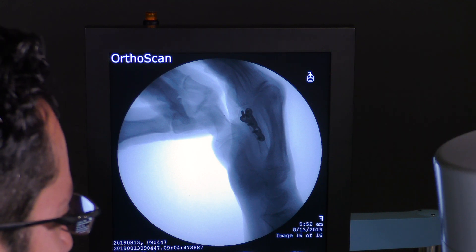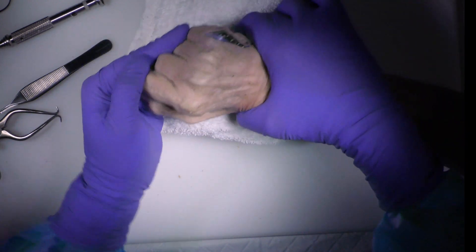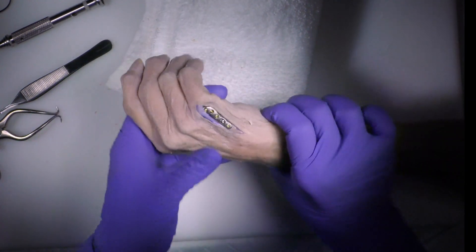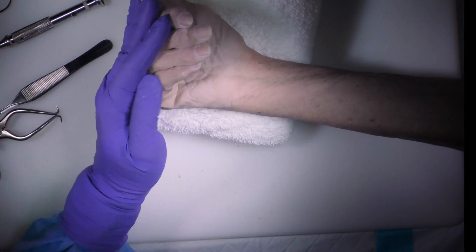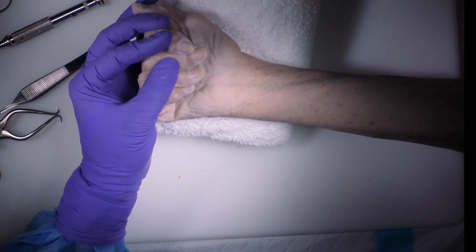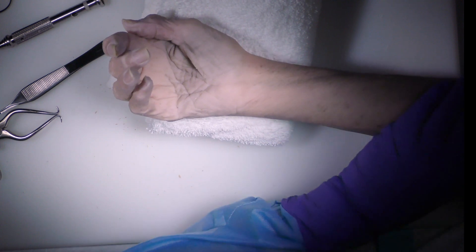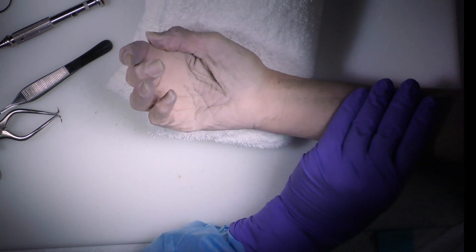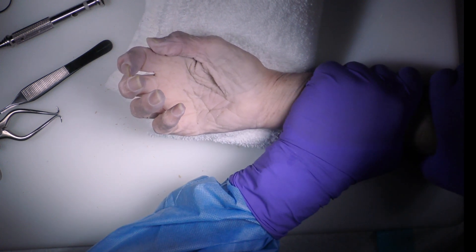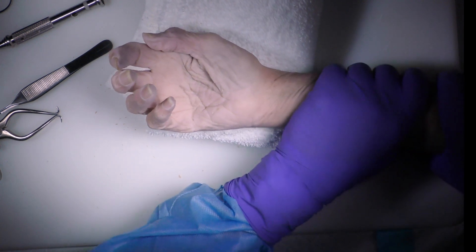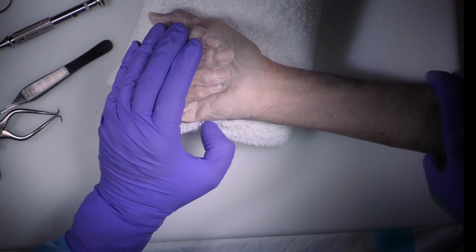They're going in different directions. When you are, whenever you're doing any kind of finger fracture surgery, you want to make sure that your cascade has been restored to your hand. It's always trickier when the patient's asleep to know for certain, but you can kind of just passively manipulate and see where it wants to go. You can tension the forearm by squeezing the forearm muscles here. Again, it's a cadaver, so they're not alive, so they don't have normal tone. You can squeeze here and this will pull down as well and make sure they're pointing all to the scaphoid.